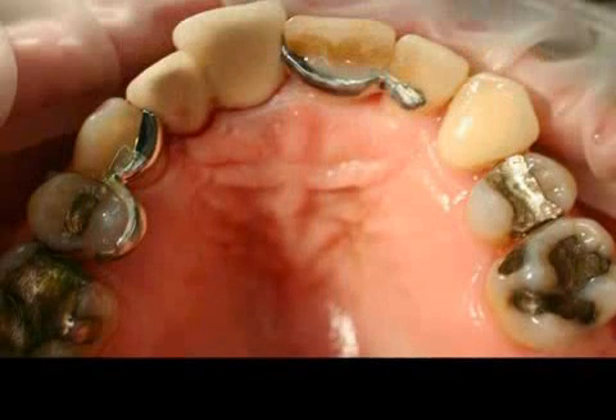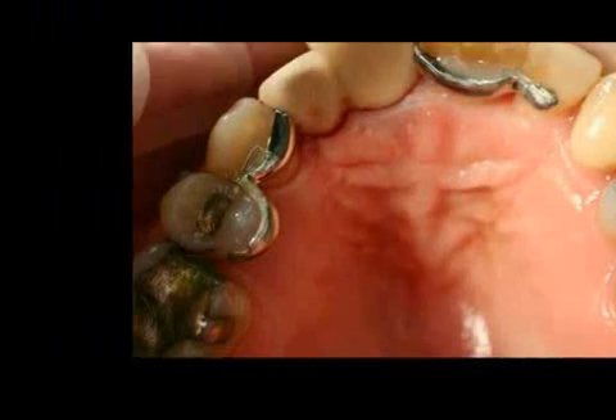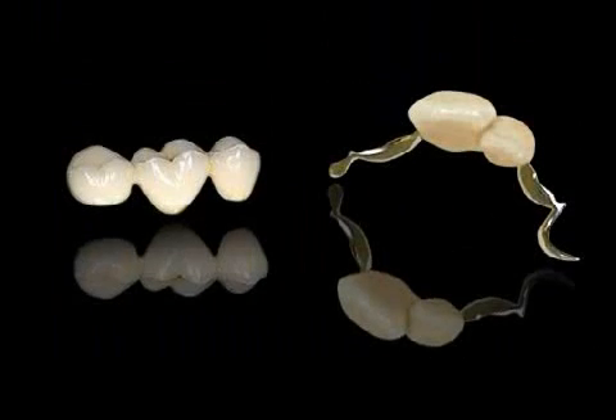The patient should get used to the metallic grips on the insides of the teeth within a matter of hours, and can look forward to bone repair followed by successful implantation. Maryland bridges are not as stable as real bridges, and are thus mainly used as a high-class interim solution. Maryland bridges may consist of a metal core, as shown in the film, or be entirely ceramic, as shown in the picture on the left.